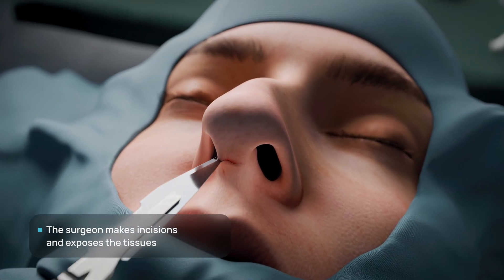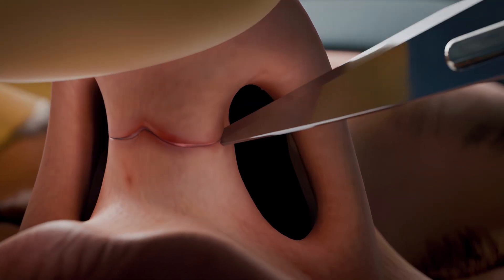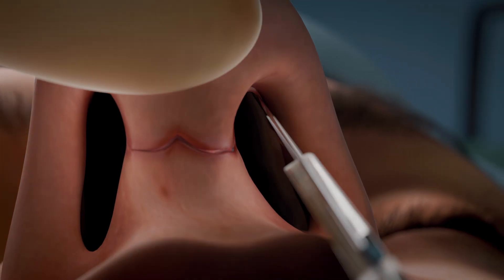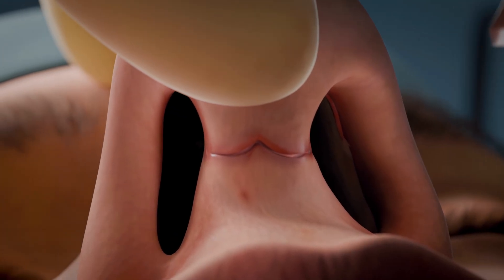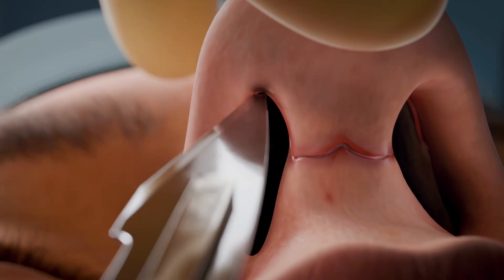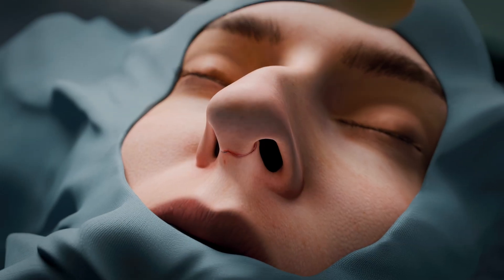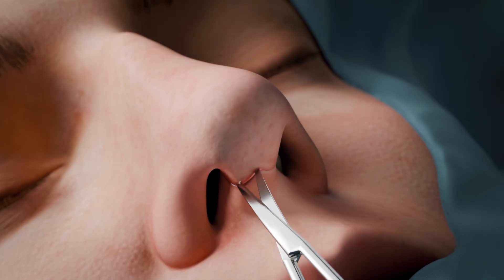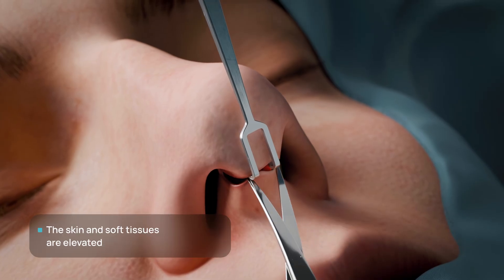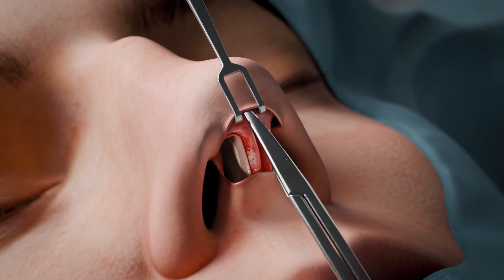The procedure begins with an incision along the columella that extends into the nasal vestibular mucosa. A mucocutaneous flap is then elevated, exposing the cartilaginous and bony framework of the external nose.